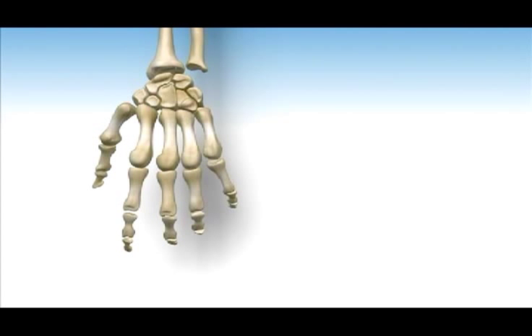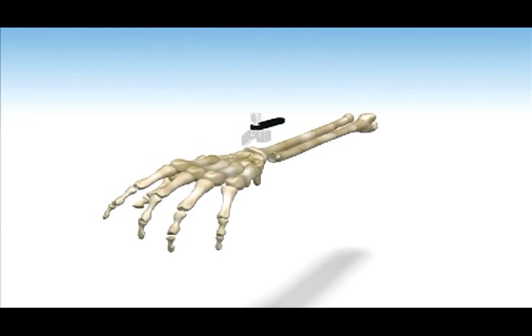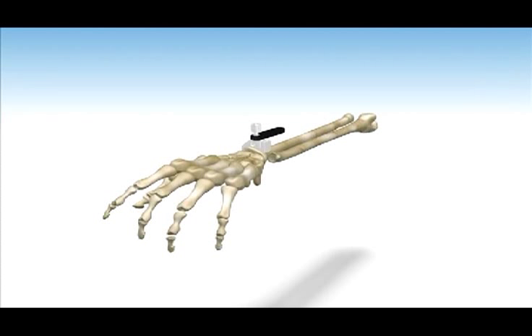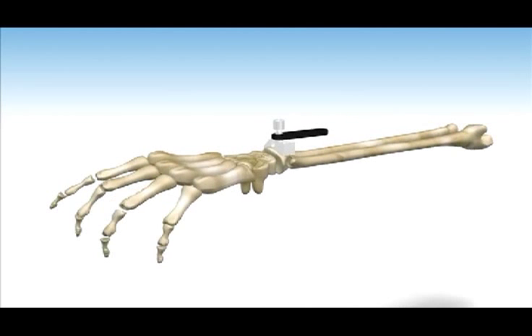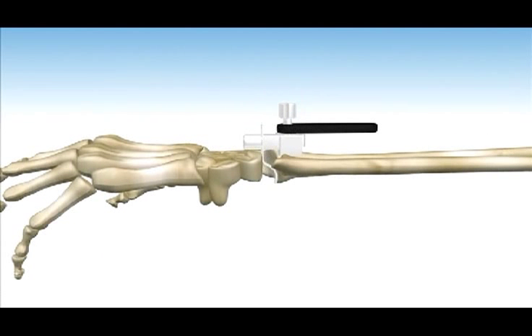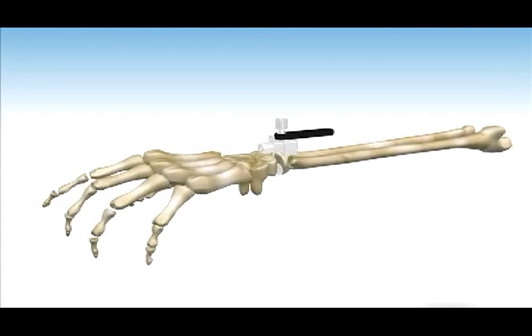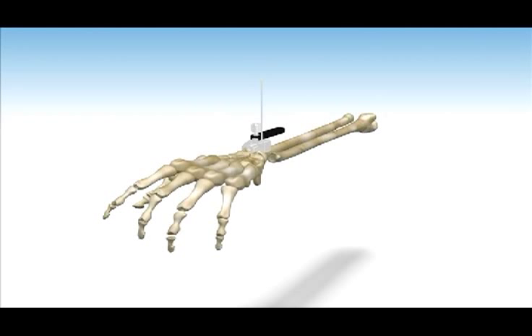Step 1. Locate the PGT guide so that it is positioned over Lister's tubercle and rests firmly on the dorsal surface of the distal radius. Assemble the PGT tab component to the radial block and mount it onto the PGT guide. Insert the tab into the radiocarpal joint, positioning it against the lunate fossa. Secure the PGT guide to the radius with two millimeter K wires. Confirm position of the PGT guide with X-ray imaging. Remove the PGT tab.